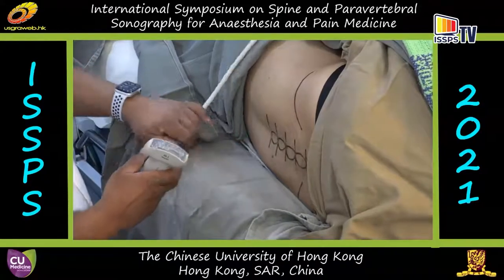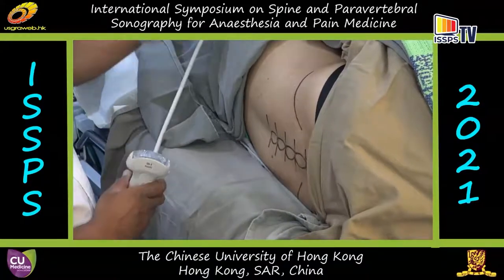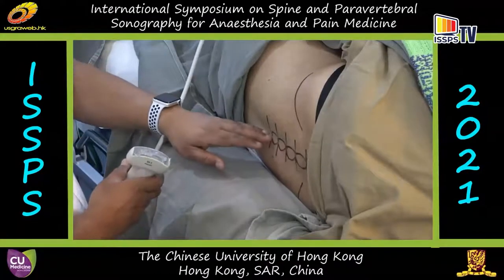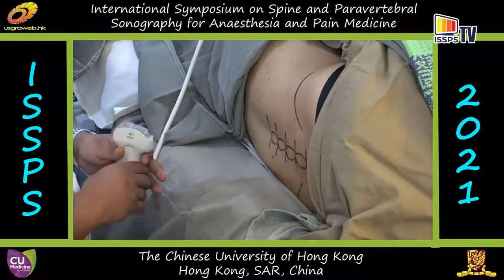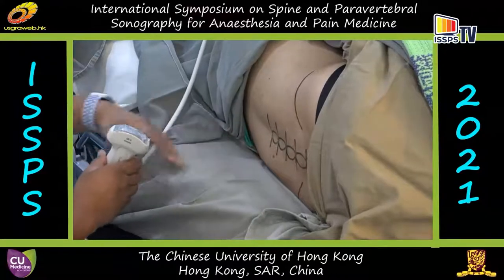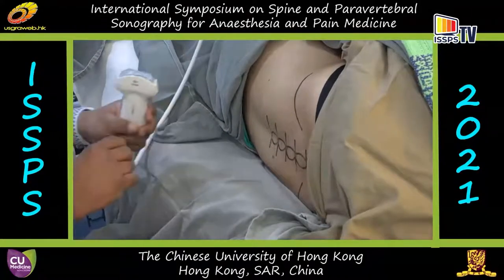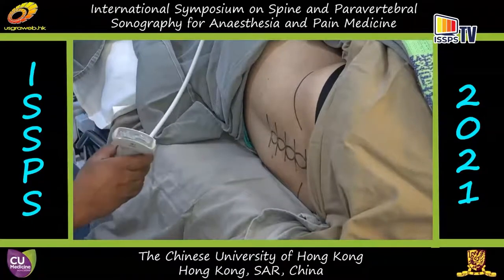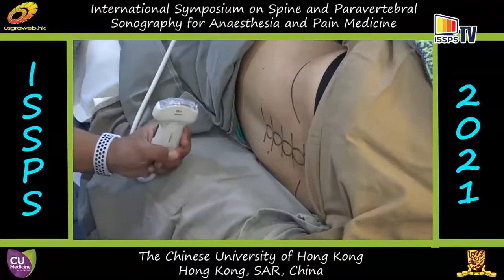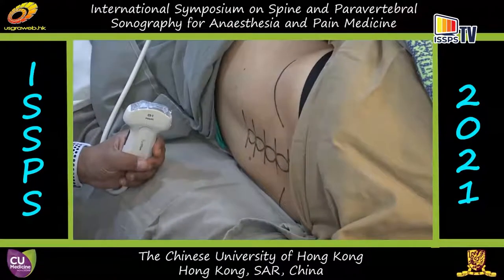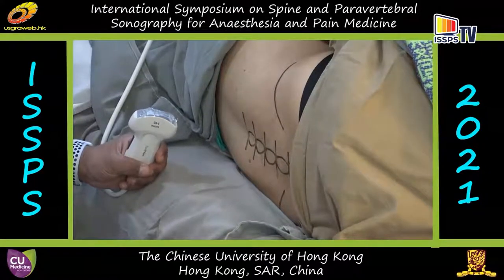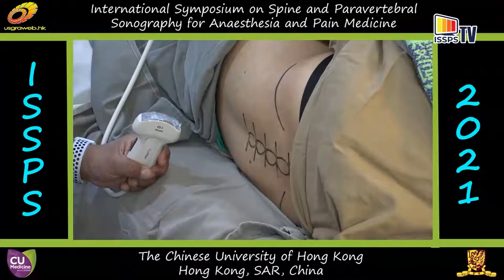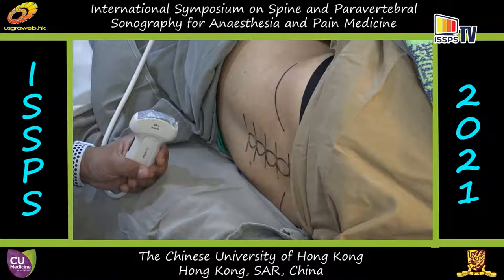Later on, when we talk about ultrasound imaging in scoliosis, we will be talking about an SP line — that means a spinous process line. We will join the tips of the spinous processes together so that we can see the spinous process line. Any deviation from this usually suggests an abnormality in orientation or some rotation in the spine.